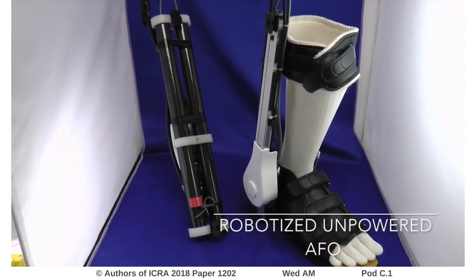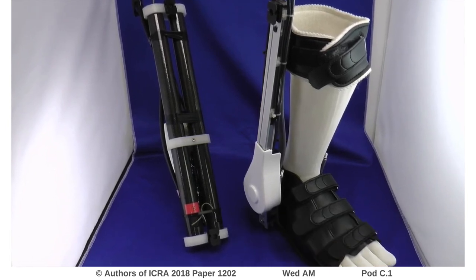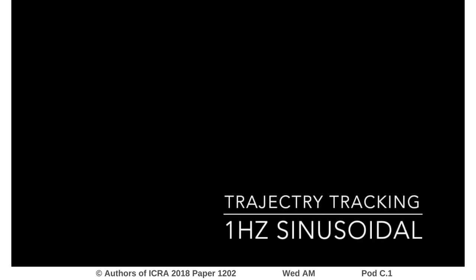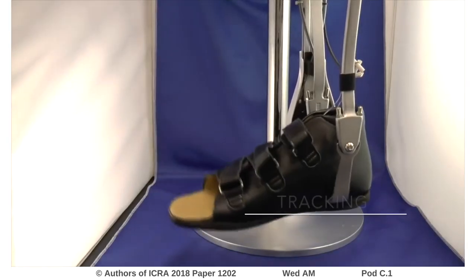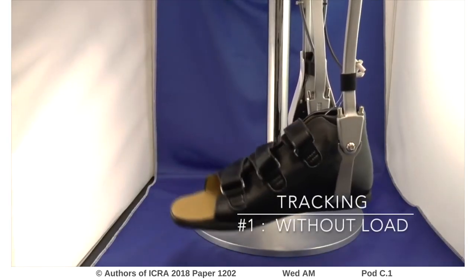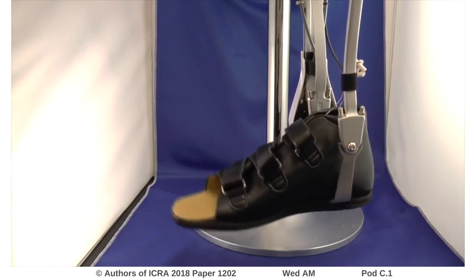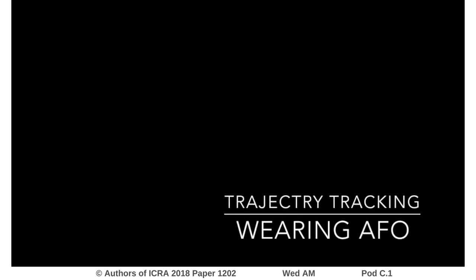Thus, our approach is robotizing an ankle-foot orthosis, which is widely used in rehabilitation facilities, by newly designing a modular joint and a tensioner for a pneumatic actuator with a Bowden cable force transmission system. This movie clip shows the target trajectory tracking performance using a sinusoidal pattern of 1 Hz, similar to a typical gait cycle. The pressure input is generated by a feed-forward model using an iterative learning control strategy.